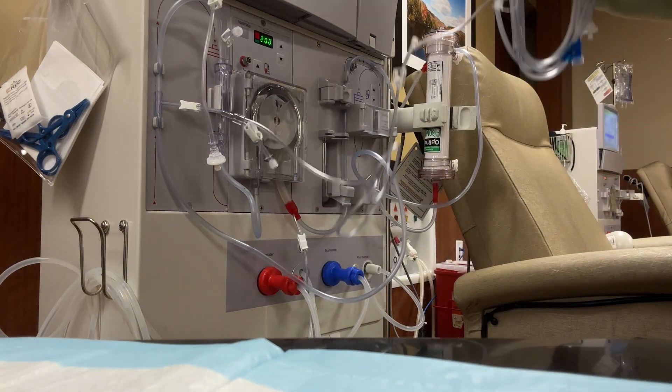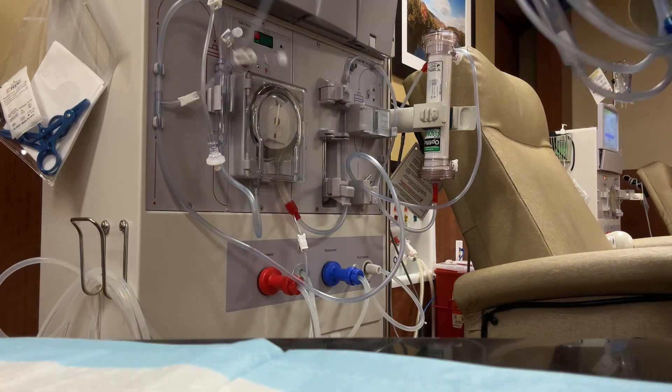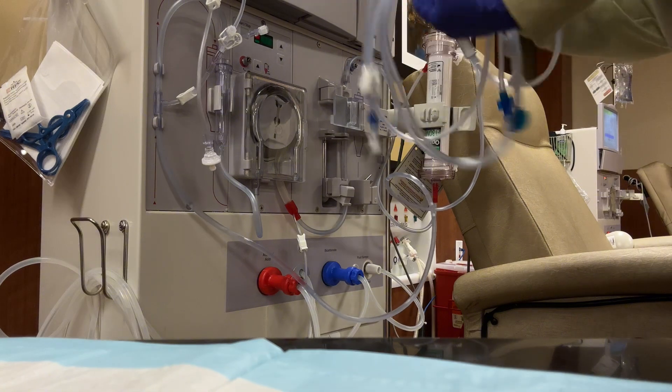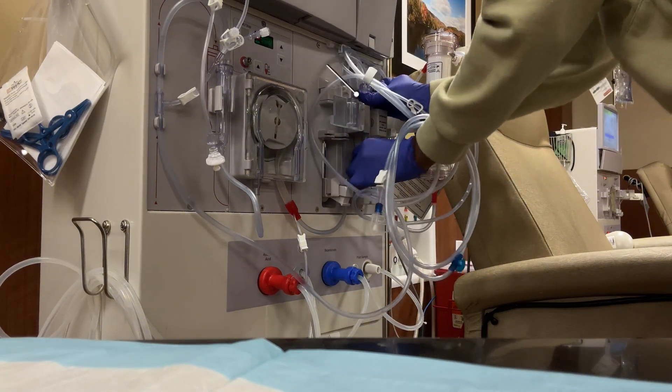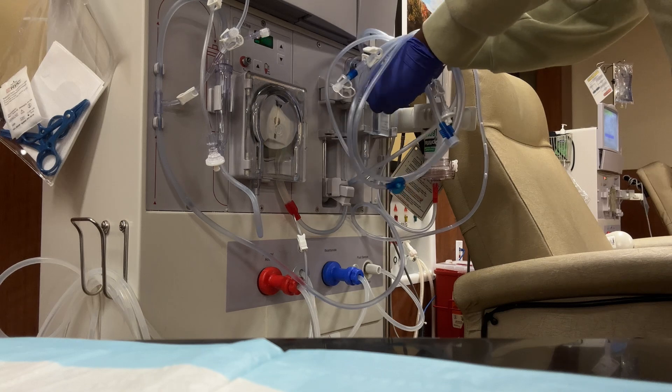So now I'm about to prime my arterial line, which gets primed by gravity. I do that as I'm setting up my venous line, because that gives it time to prime where I know the air bubbles are out, as you see.